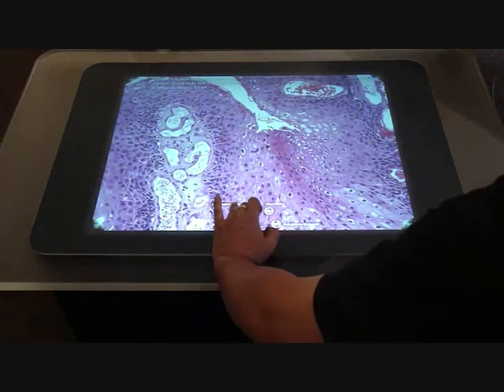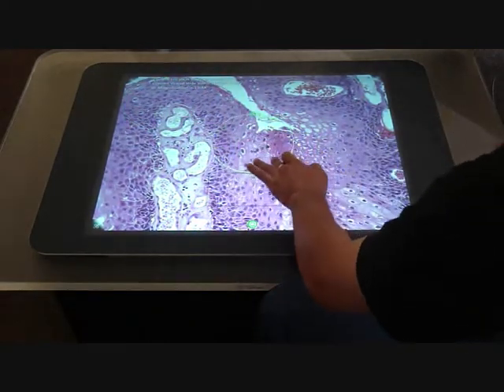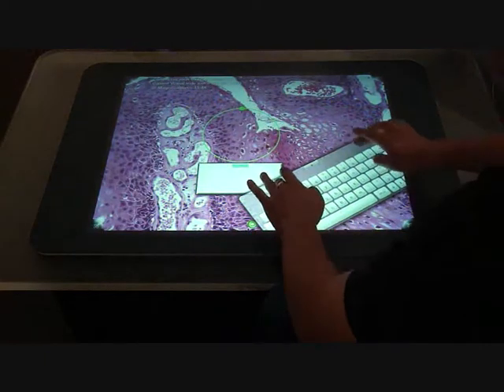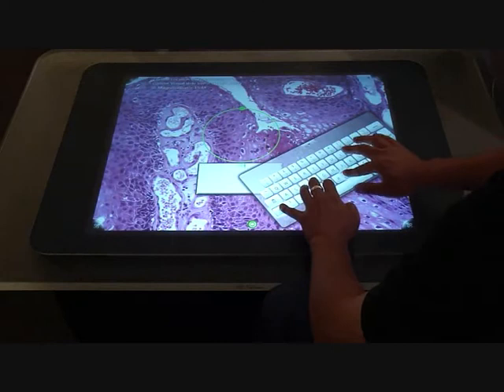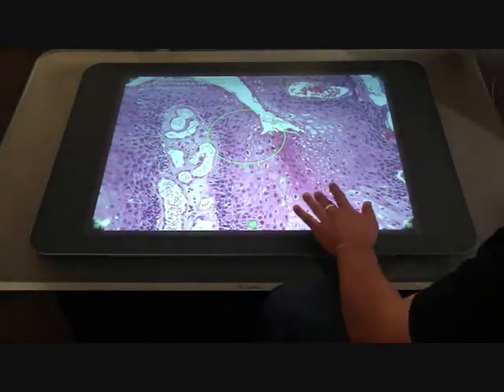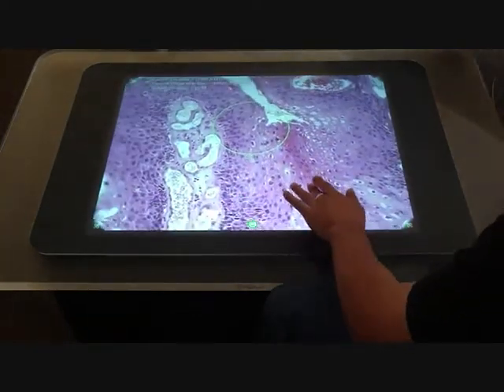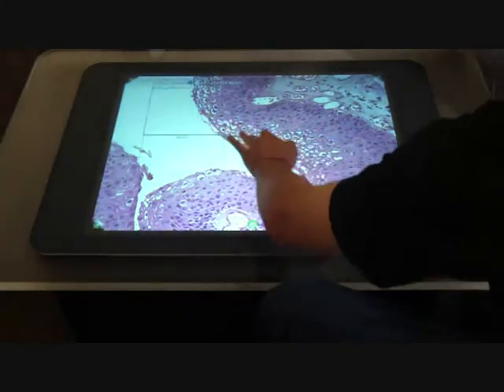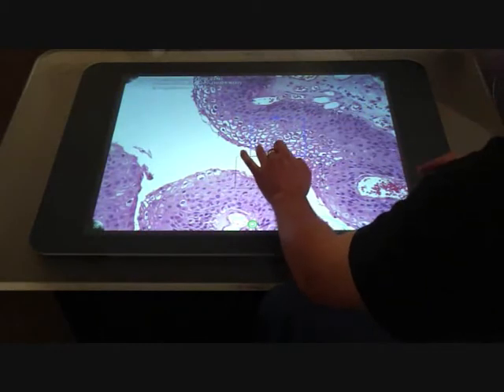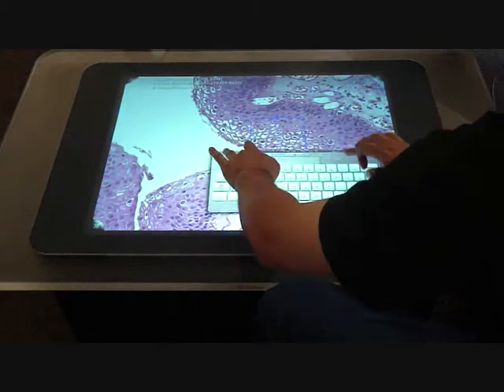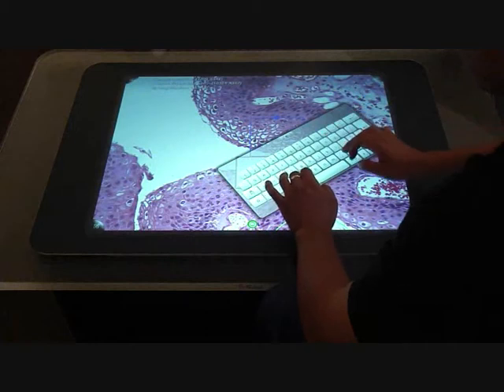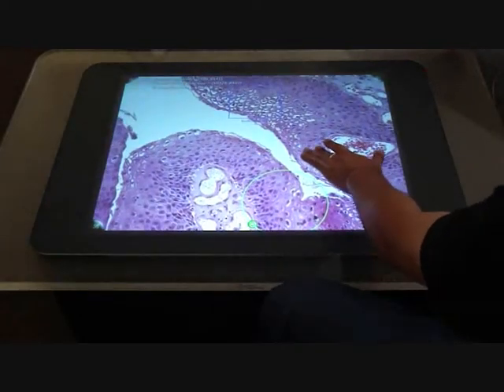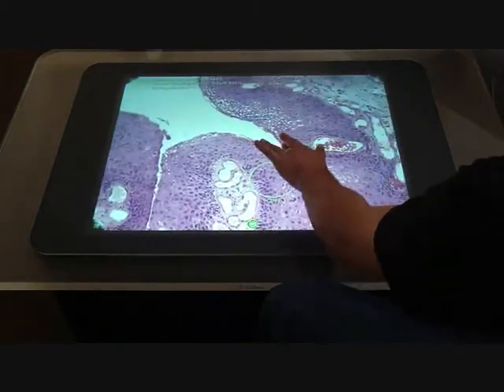You can also add annotations to the Surface table. For example, if you are interested in a region and want to label it as scene 1, you type it in and press enter — the annotation is then fixed and embedded in the virtual slide. If we go to another region, we can also put in another type of annotation, which is a rectangle. For instance, if we believe a region shows koilocytosis, we type it in and press enter. Now you have two annotations embedded in the virtual slide, and you can still zoom, pan, and navigate freely.